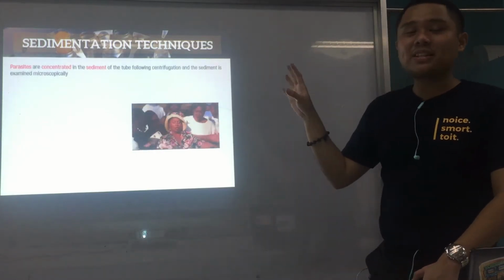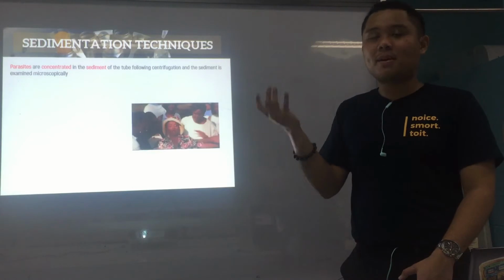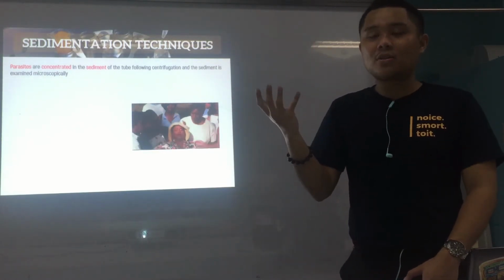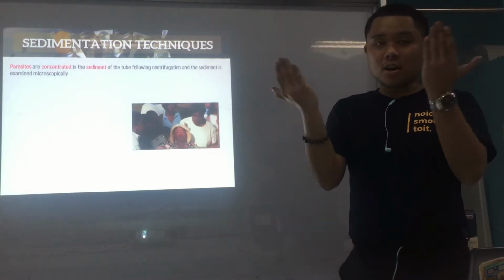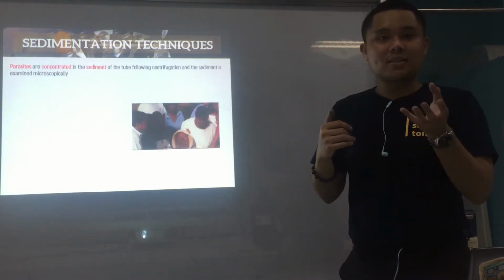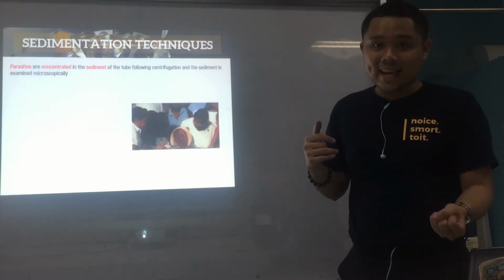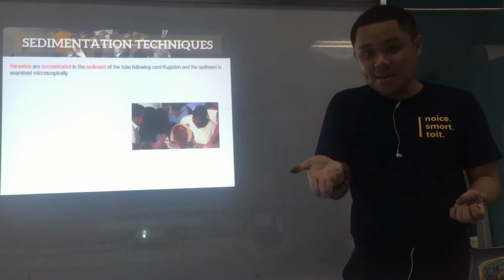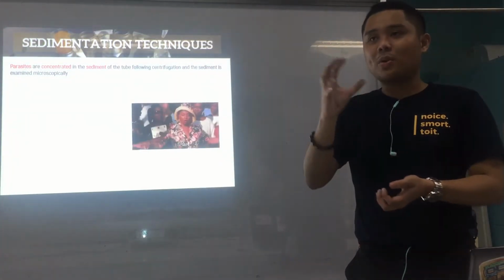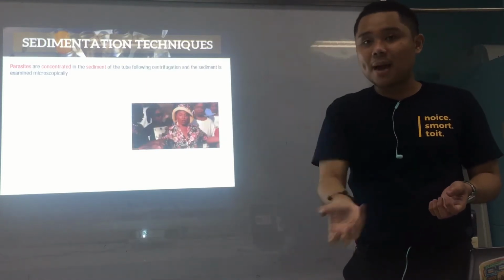Now again, the difference with the principle is that sedimentation, by the name itself, means parasites this time are much denser than the fluid surrounding them. Because they are denser and heavier, they will sink and be recovered at the sediment below. Therefore, that's the name, sediment. So we don't examine the surface, we examine the sediment.